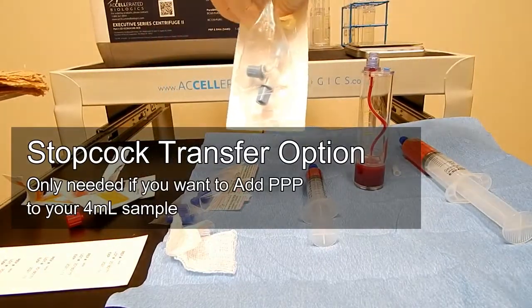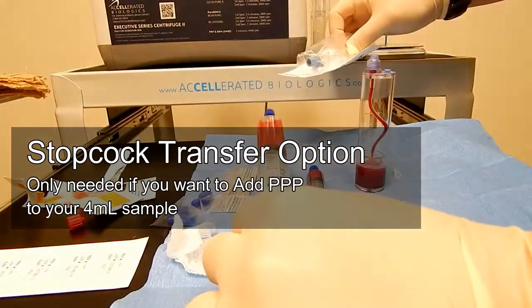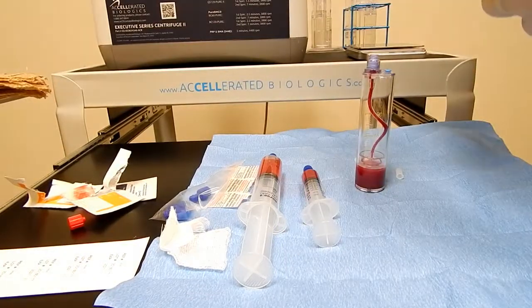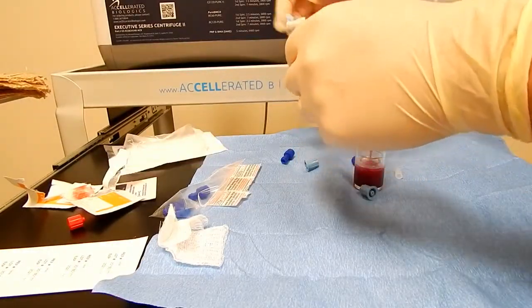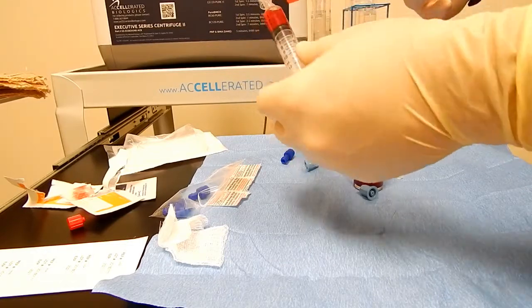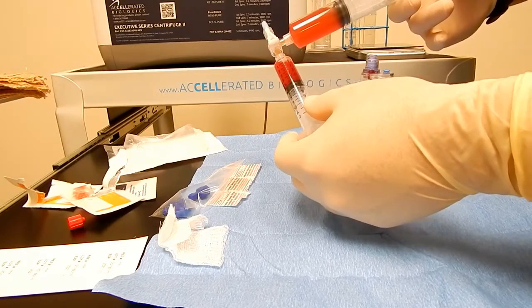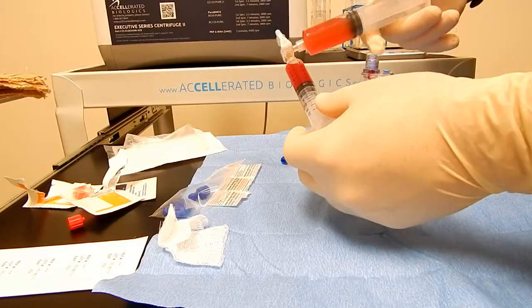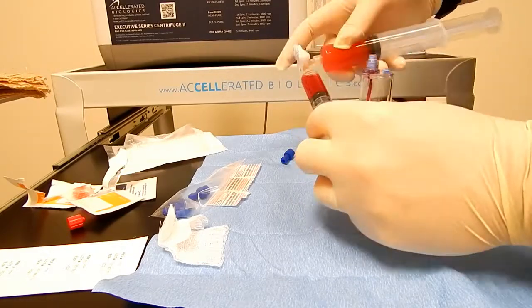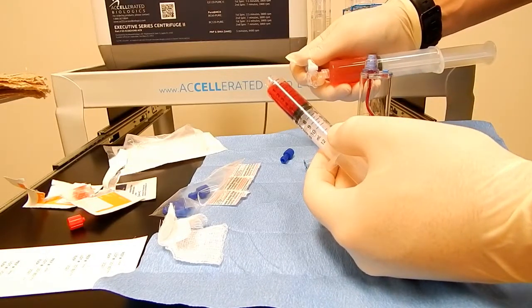The stopcock feature is added to the kit if you want to add more of your platelet-poor plasma to your PRP sample. You can add another 1 or 2 cc's back to your PRP if you needed any more volume to your final PRP solution.